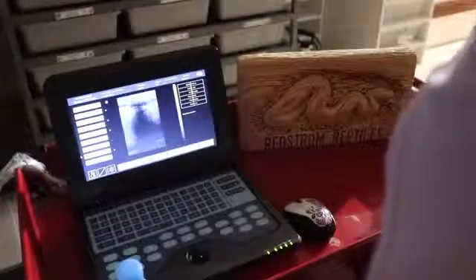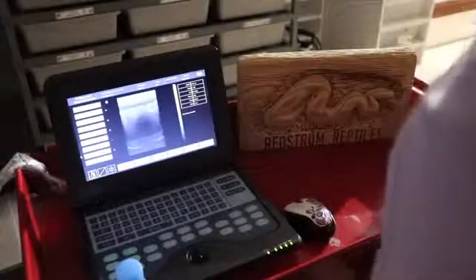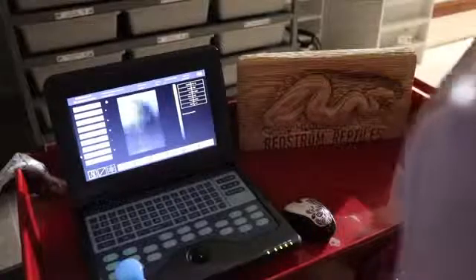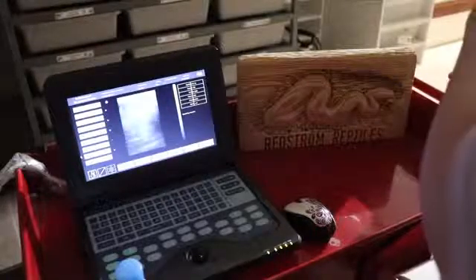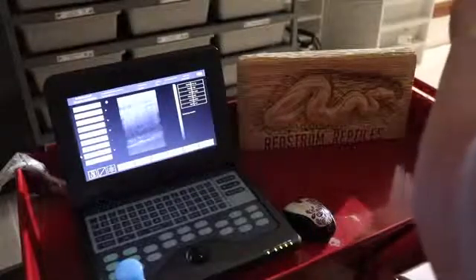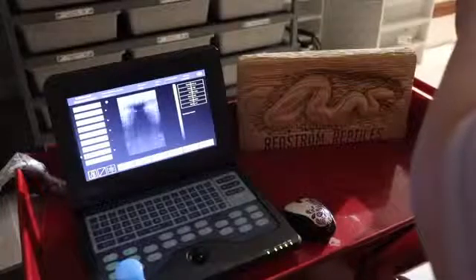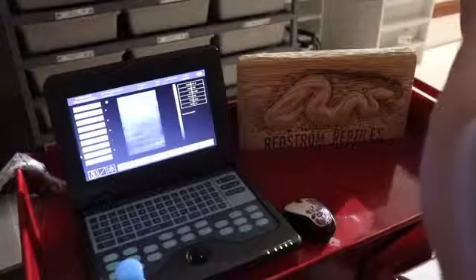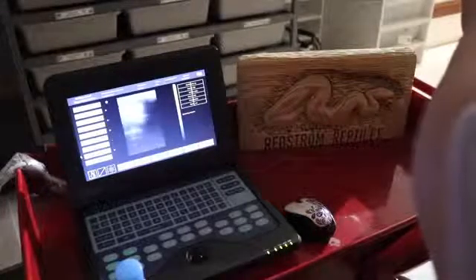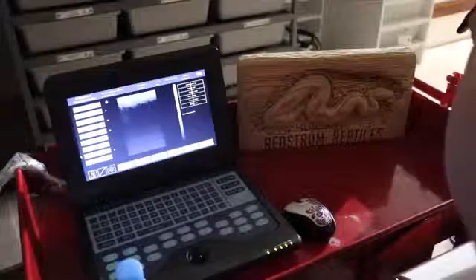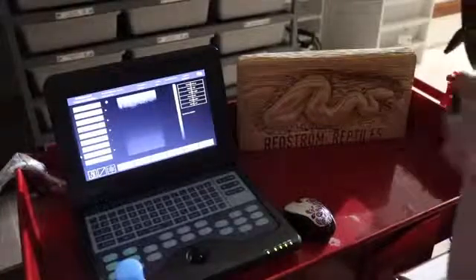Five, running out of gel. She's fighting me a little here. Six. Looks like six. So it looks like we're looking at six eggs from this girl, and that's pretty cool.